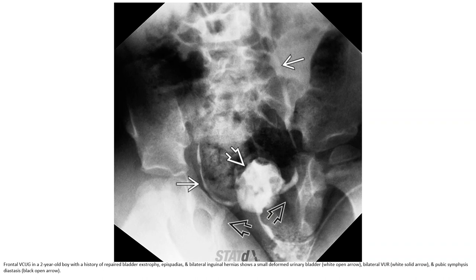This is a video of VCUG in a 2-year-old boy with a history of repaired bladder exstrophy, epispadias, and bilateral undescended testes, showing a small reformed urinary bladder, bilateral VUR, and pubic symphysis diastasis.